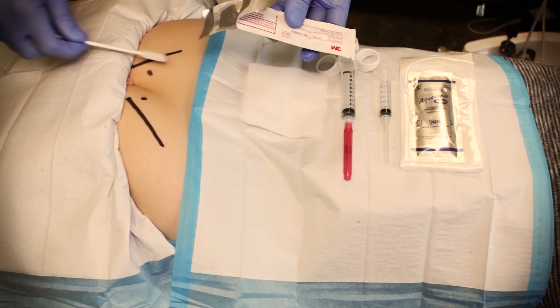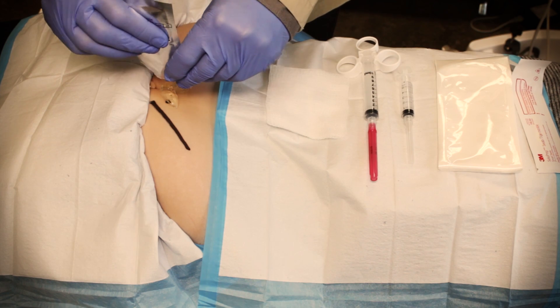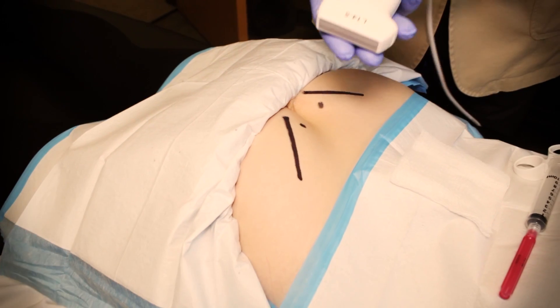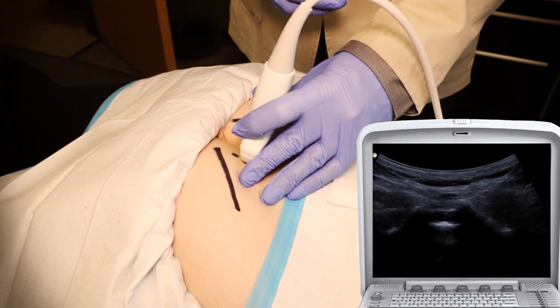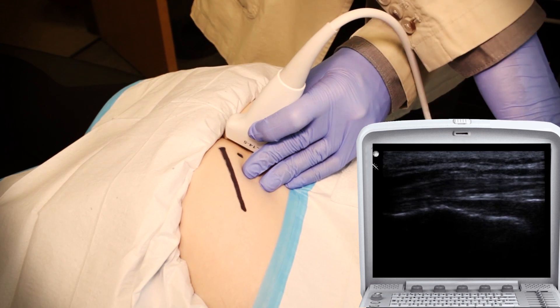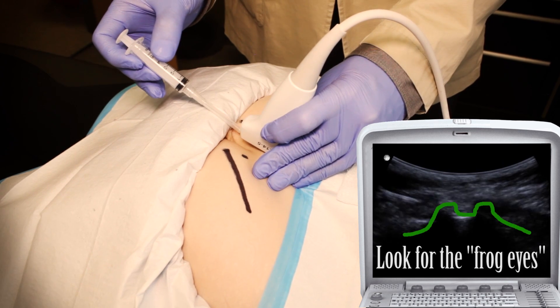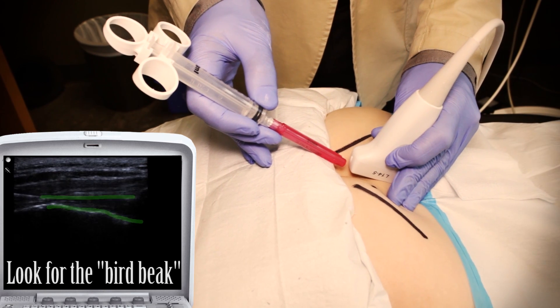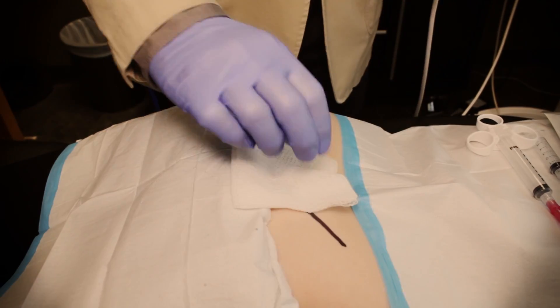First, the area is cleansed several times. Ultrasound gel is then placed in the region, and we can use either the small probe or, in larger patients, the abdominal probe. The probe is started transversely to find the sacral cornu and then turned longitudinally. Once that's found, the patient is warned and the freezing is put in. Once the freezing has taken effect, the epidural is done. Gauze is put down and the procedure is finished.